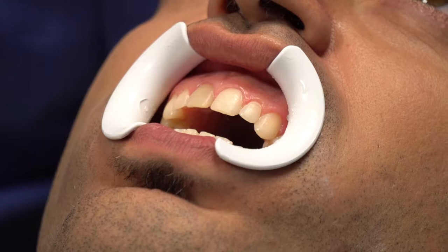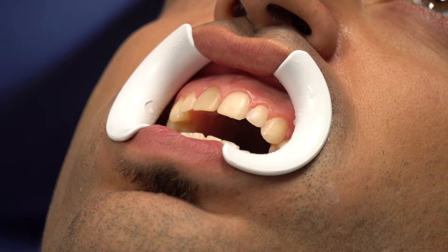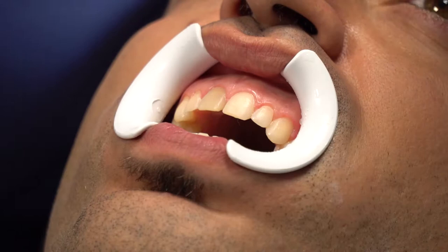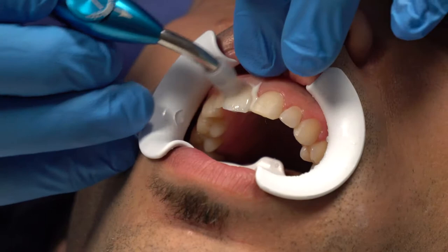Trial run because we have a dark right front and a normal left. Let's take Ultrabond Supreme White and try teeth 8 and 9. What I'm thinking is: am I going to see shine-through — which I think I am — and do I paint the opaquer on the tooth? Do I prep the tooth a little? Do I not prep and use more opaquer? Will the opaquer come to the surface? Do I have to layer the opaquer? We'll see what happens. So, what do you see?